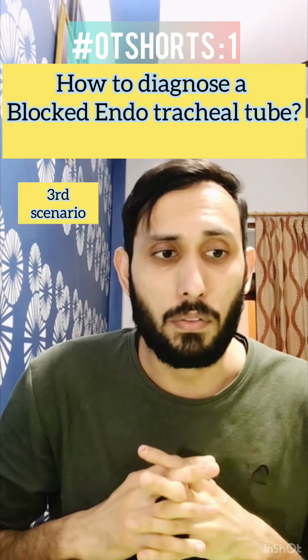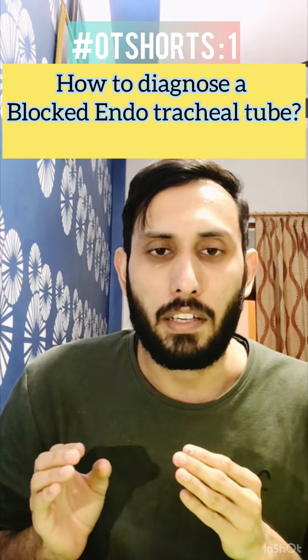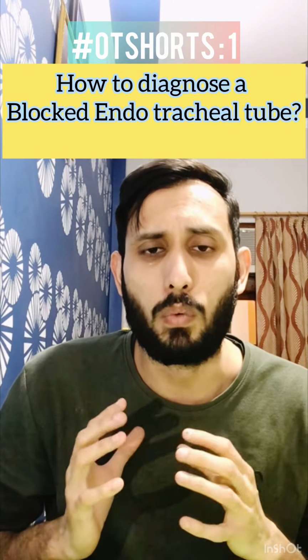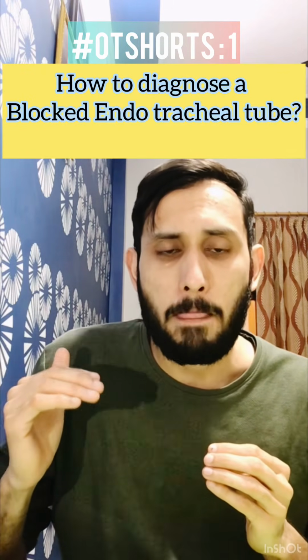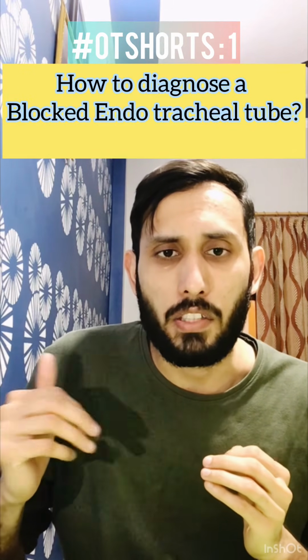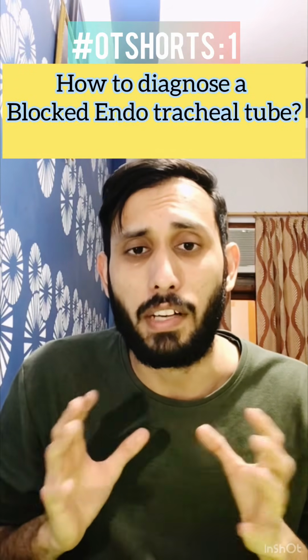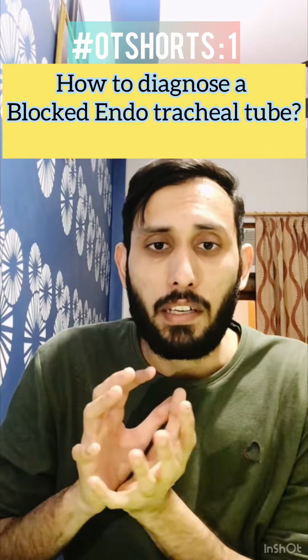The third scenario is if the patient is in the ICU and you have already connected the patient to the ventilator, and you do not know when the tube was last suctioned and what the baseline was. So there is an increase in peak pressures or a change in the end tidal CO2, and you don't know what the baseline was. So you detach the ventilator from the patient. This is the fastest way to know whether the tube is blocked or not. You attach the ambu bag. So here comes the importance.